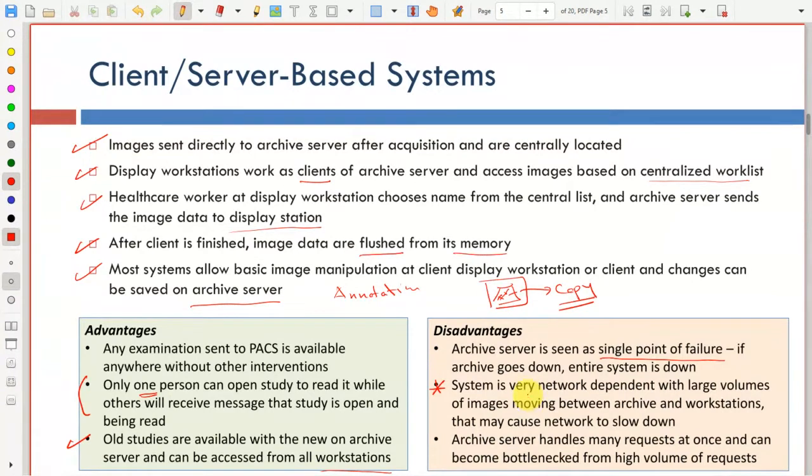And usually when you have that much data, of course, you have multiple sources of data, and you have many workstations retrieving the data for different patients from different time points, even from old cases and new cases and things of that sort. So basically, network performance is critical here. The whole system is dependent on the network performance to perform well.